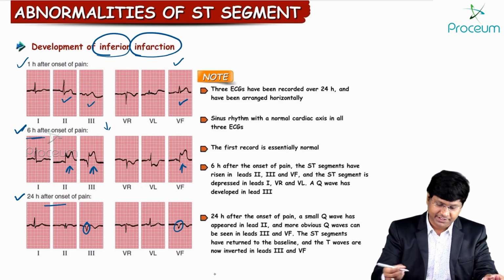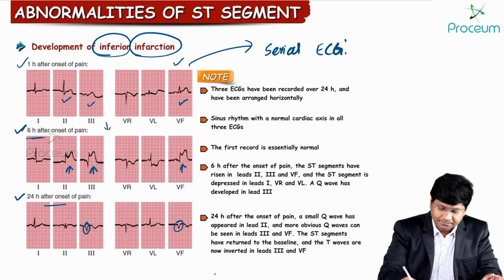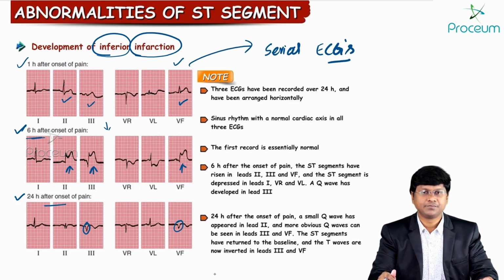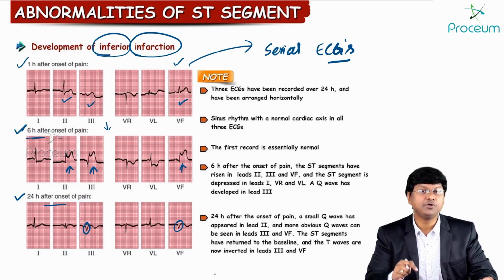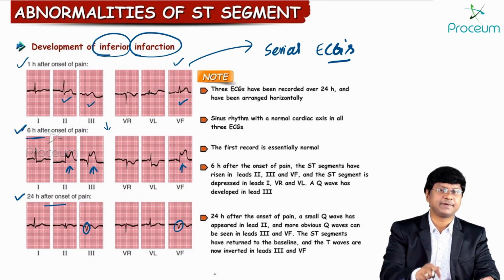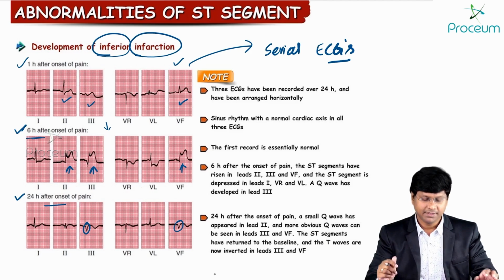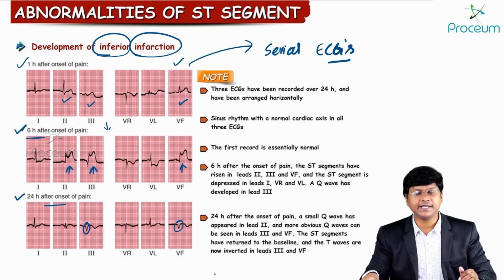What you have to do for this patient is, you have to take a minimum of 3 serial ECGs. Right? Every 45 minutes, you repeat the ECG. And the serial ECGs can pick up the abnormality if there is the presence of the underlying infarction. Okay? Right. Then followed by that, you see the next clinical question.